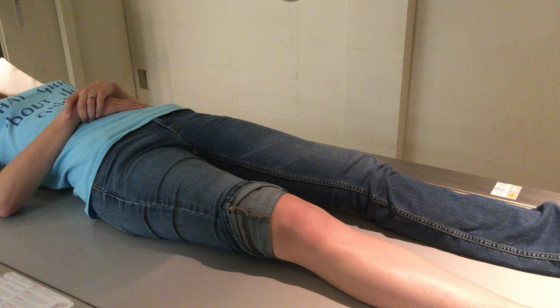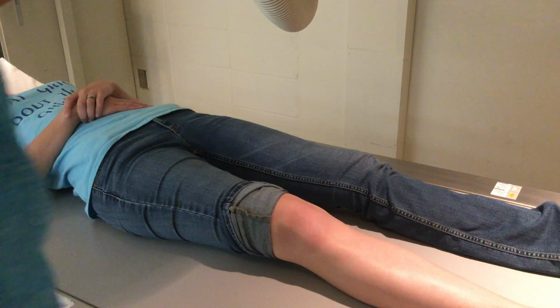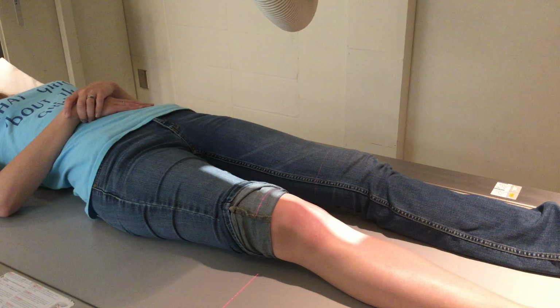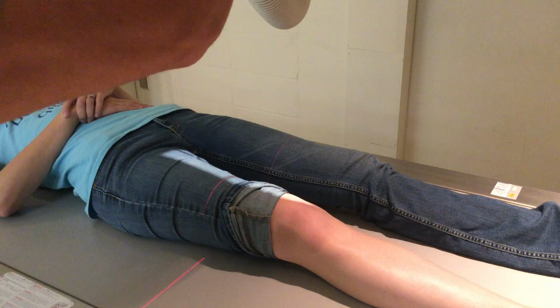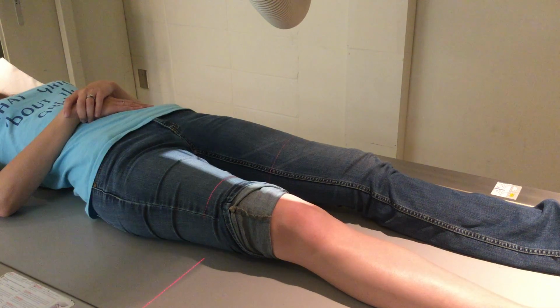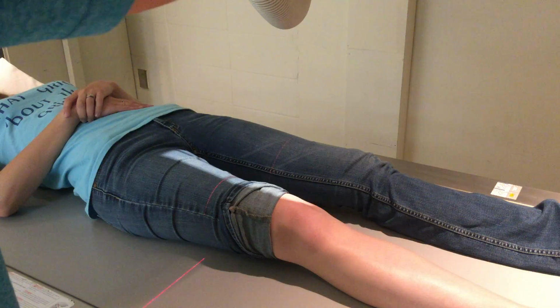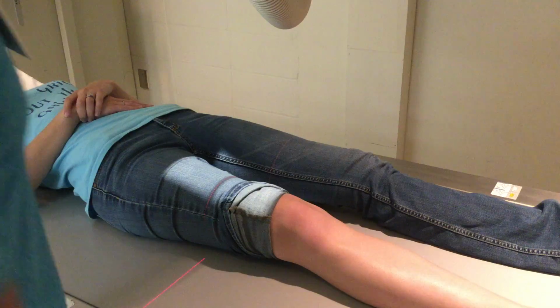You'll be on table bucky, so you'll set your technical factors outside the room before you come in. Your angle on a knee actually varies from caudal 5 degrees all the way to cephalic. So typically on my AP and lateral, I use a cephalic angle of approximately 5 degrees. The bigger the hips, a little bit more angle. Make sure you're on PBL, positive beam limitation. You'll learn all this in class.